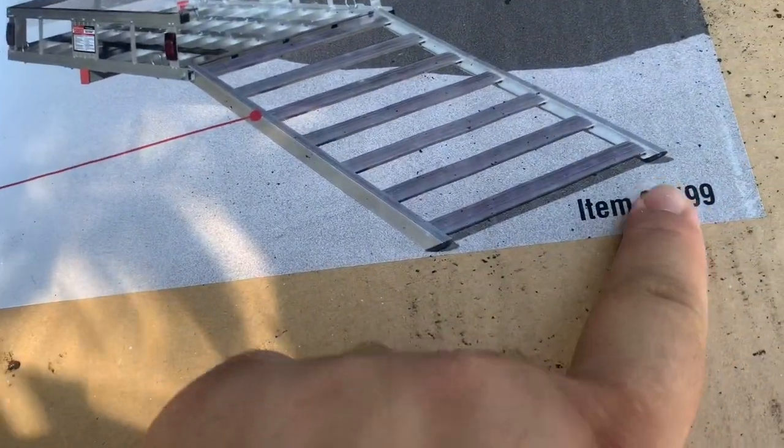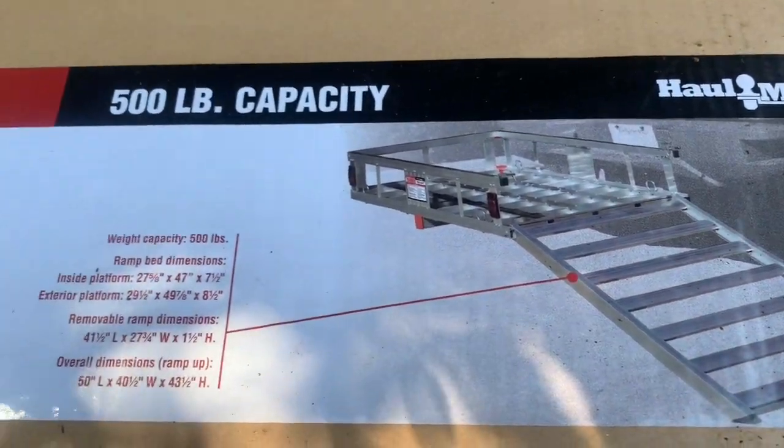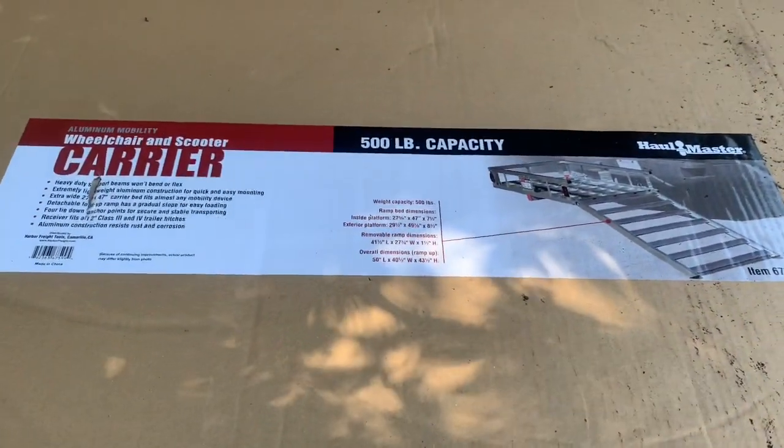Here's the item number if you need it: 67599. And this is the ramp. Let's put this together and see what it takes. We'll see how it works out today.